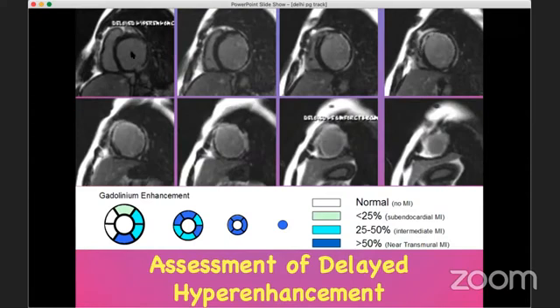You can again see the same stack of 8 images that you saw in cine, that you saw in perfusion, and now you're seeing it in delayed, and you can see the white here. I'm trying to point to it. And you can also see the healthy black area. So in MR, white is dead tissue and black is live tissue in whatever disease entity you see. So the presence of white basically means death or disease, and we call it technically hyper-enhancement.